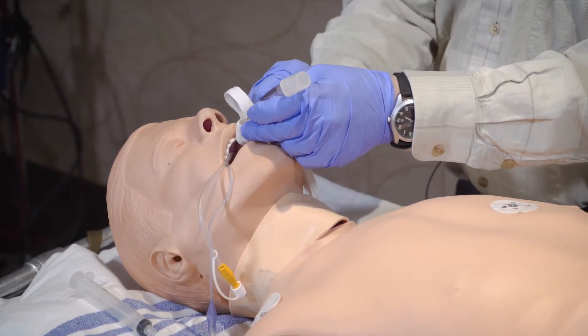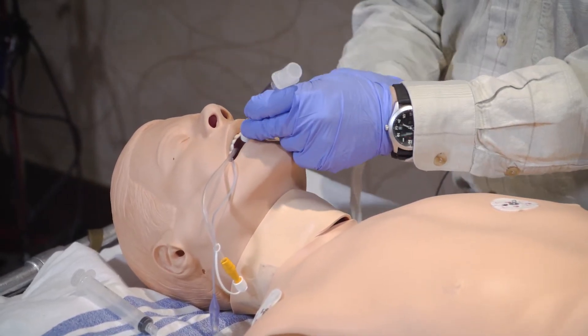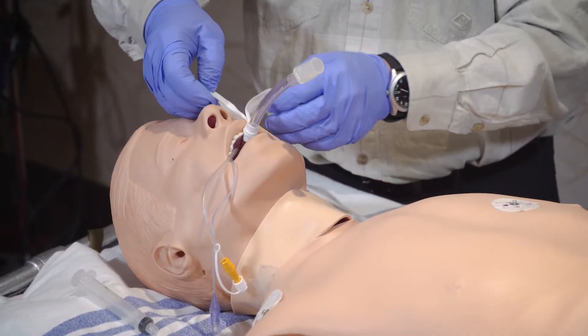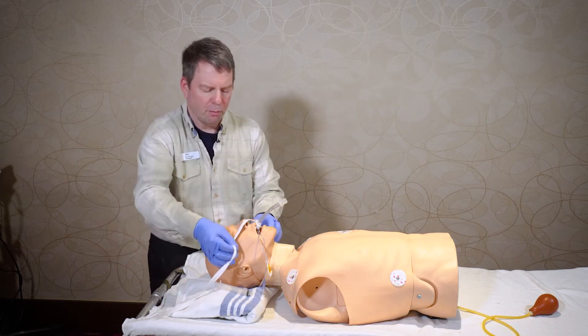Then take the two ends and just tighten up the loop so that the fold of the twill tie is on the top, and then you're going to take the two ends and pull them apart.